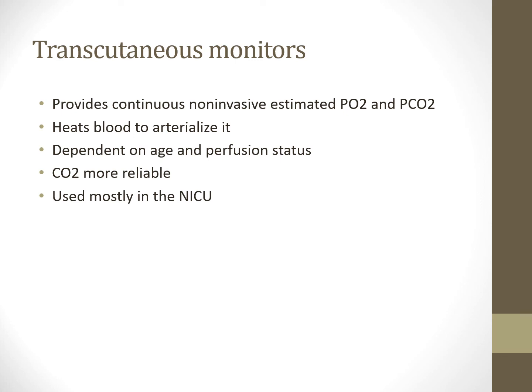The shark fin thing, I need to bring some of those in for you guys. But you can Google image shark fin capnography, and that's a classic sign of air trapping or auto PEEP, especially with your asthma or emphysema patients. It's a big bad sign.